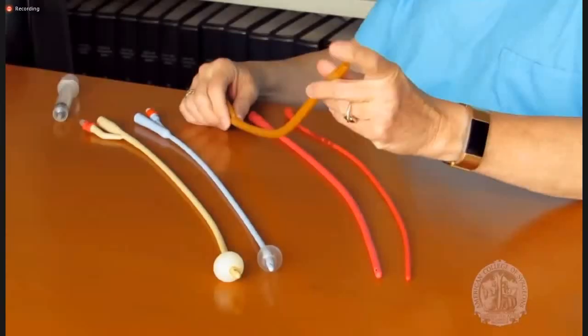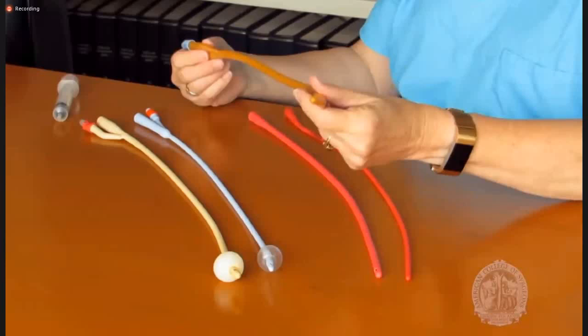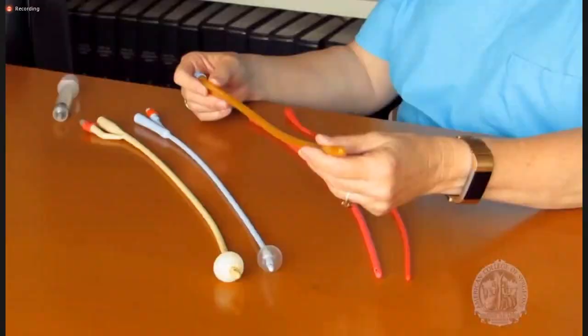Other forms of indwelling catheters also exist. The Coude catheter is a catheter with a bulbous tip and a curved end, and it's used for patients who have urethral obstructions, such as from benign prostatic hypertrophy. It's placed using a bit of pressure, but the principle of placing it is the same.